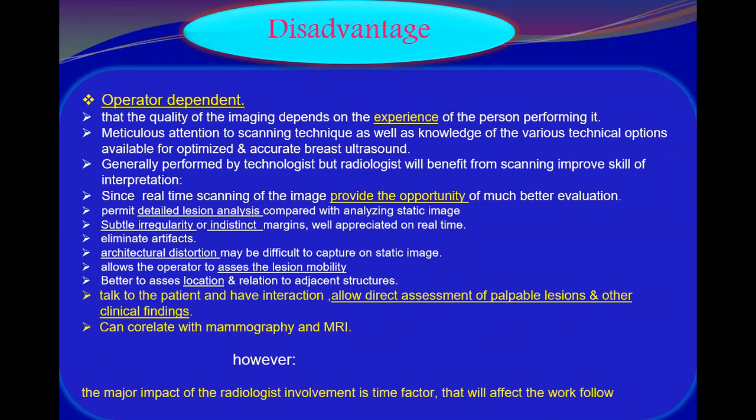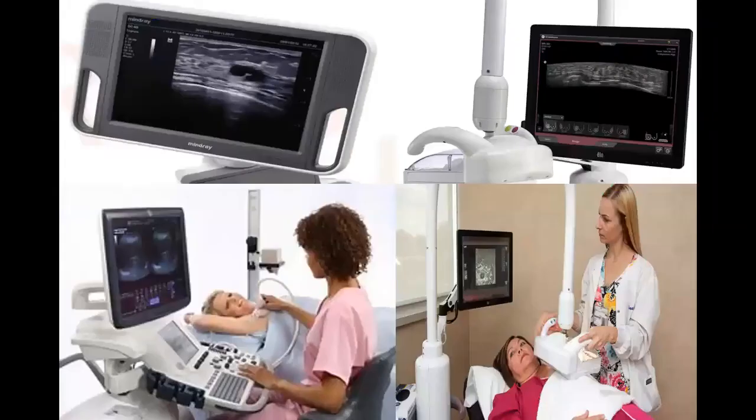How to manage this? By the new era of 3D ultrasound. It's helping with these limitations of handheld ultrasounds.